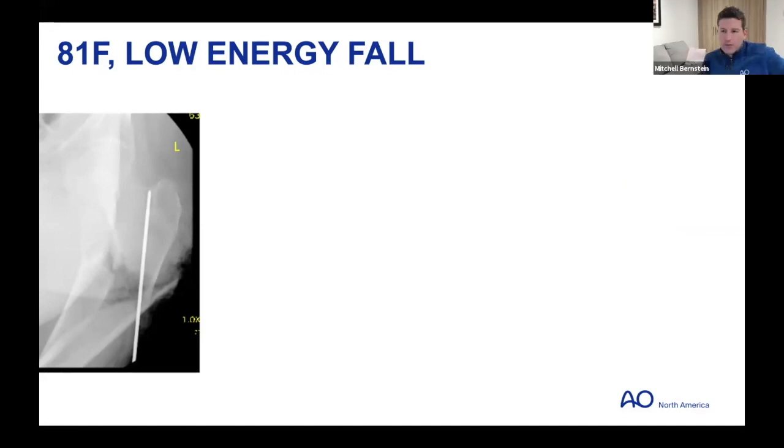So again, preoperatively, I determined this was going to be an open reduction necessary to restore alignment. Were you thinking open reduction to control the head neck entry point, or once there's comminution down the shaft, it becomes a little bit difficult to start? You start getting obsessed with the spiral, and then you're putting a spiral back together, and then you're putting that back together to the shaft. So were you thinking more head neck segment entry point, and you're going to close reduce to the shaft?